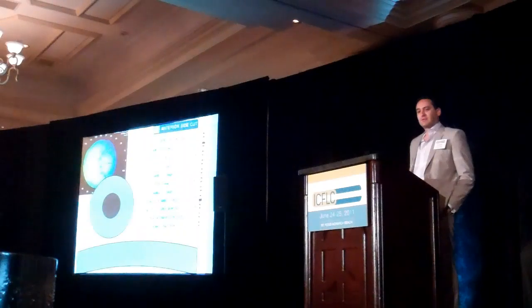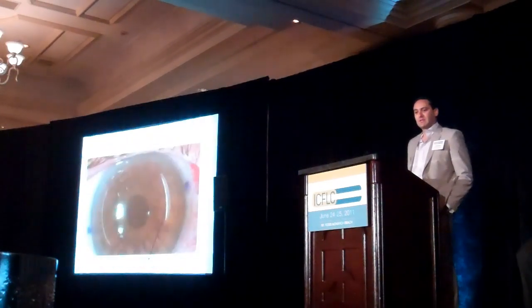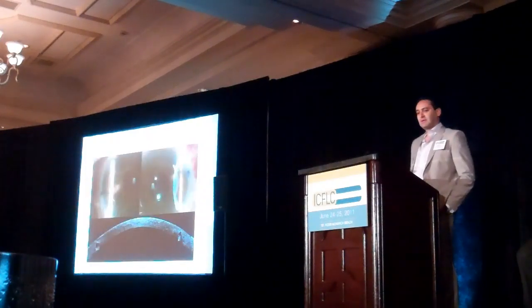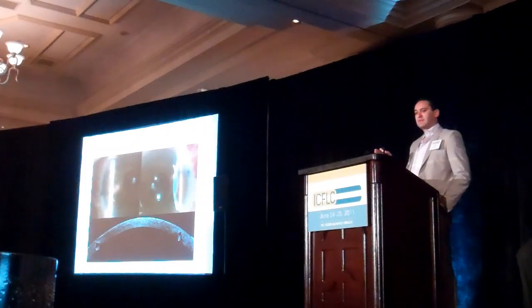Okay? So this patient was treated, and we used our current IntraLase. This is an off-label use again to do this, and we did a sub-Bowman's incision, and you can see this is immediately post-operative. It was minutes after surgery, we rolled the patient to the slit lamp, took a photograph, and you can see the angled incision that's present here. And then you can see what the anterior segment OCT shows where the femtolaser did this sub-Bowman's incision. So the question is, how long does that last? What happens to this a month later? What happens to this 3 months later? And is the effect still present?